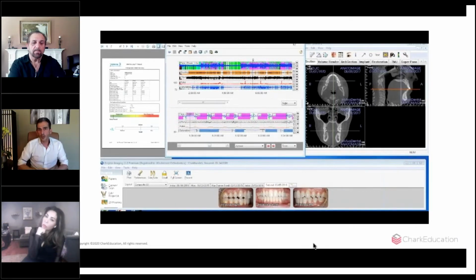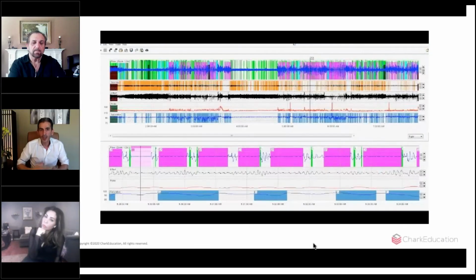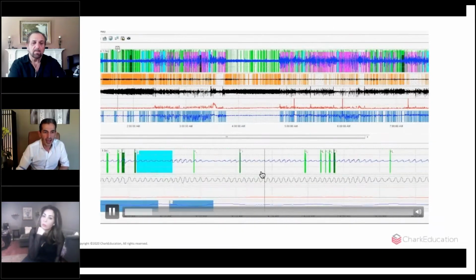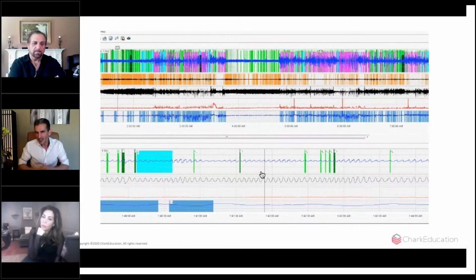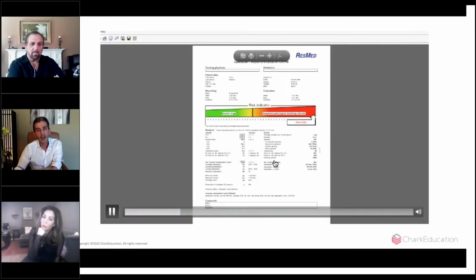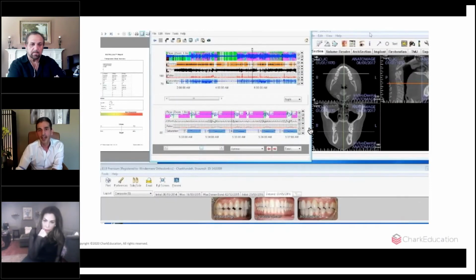We always start with their sleep apnea testing. We'll bring up the sleep testing. I usually go first to where the breathing is normal. We show them what normal breathing looks like, so they know they can breathe normally throughout the night. Then I go to where they're having apneas and hypopneas. Again, we're using visual aids quite a bit. Hey, look at this. You stop breathing for a minute here. Well, Mr. John, looks like you have sleep apnea and you stop breathing 50 times an hour. Or maybe we have that information prior to that.